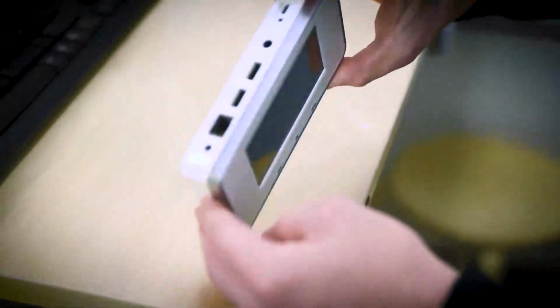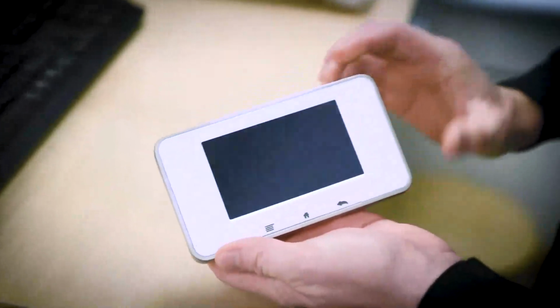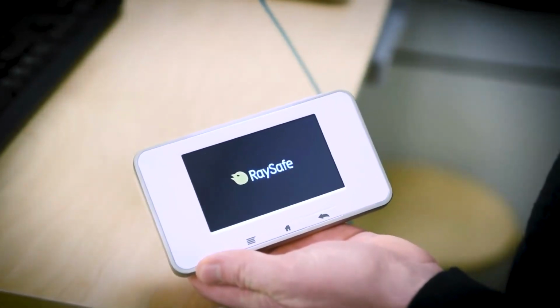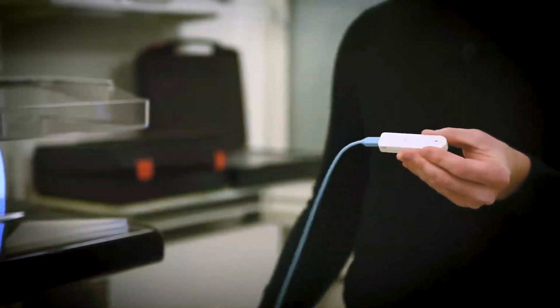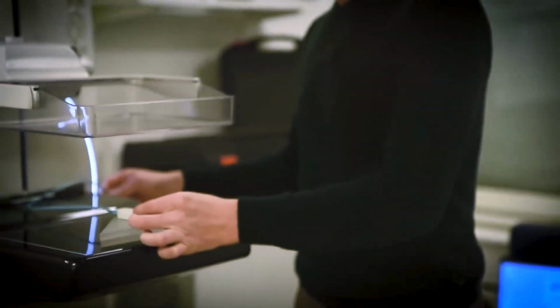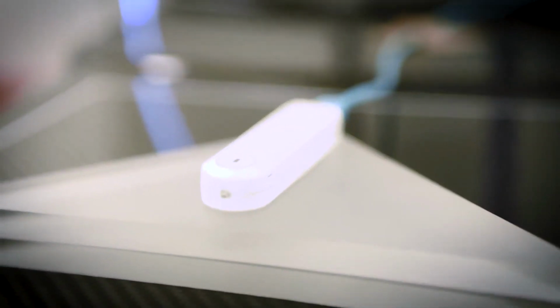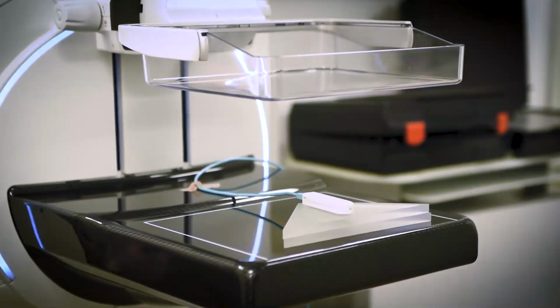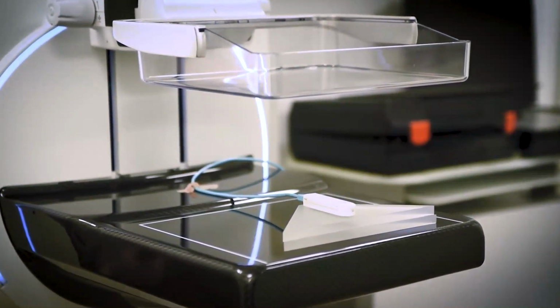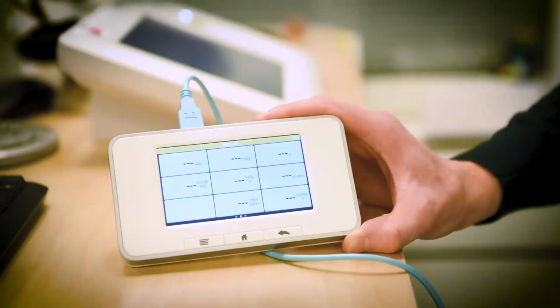Turn on the base unit. Then connect the sensor. Place the sensor on the examination board according to applicable regulations. In Europe, that is 6 centimeters from the chest wall and elevated 4 centimeters. In the US, it's 4 centimeters from the chest wall and elevated 4.5 centimeters. Make an exposure and read the values.